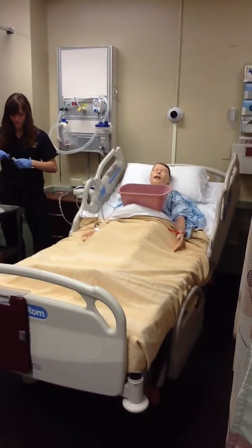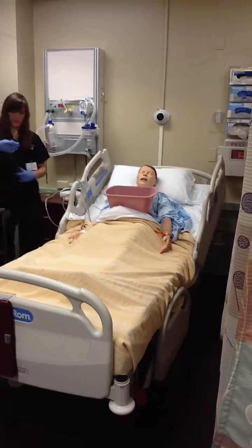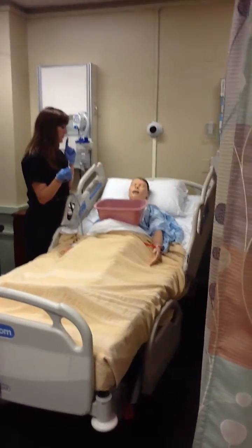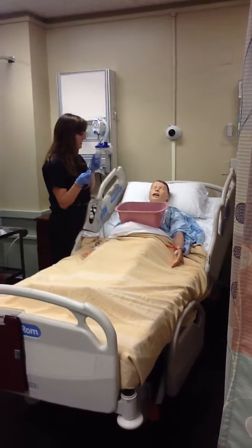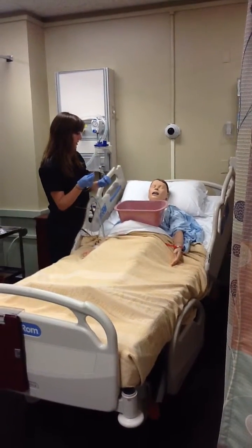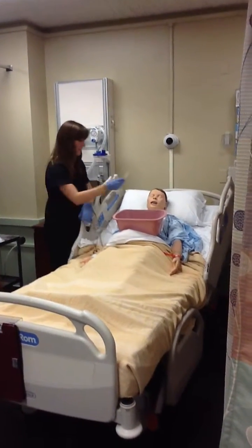Can you go ahead and close one side of your nose for me and breathe in and out? And then do the other side for me. What side was it easier to breathe in through? Your right — okay, I'm going to go ahead and do your right then.